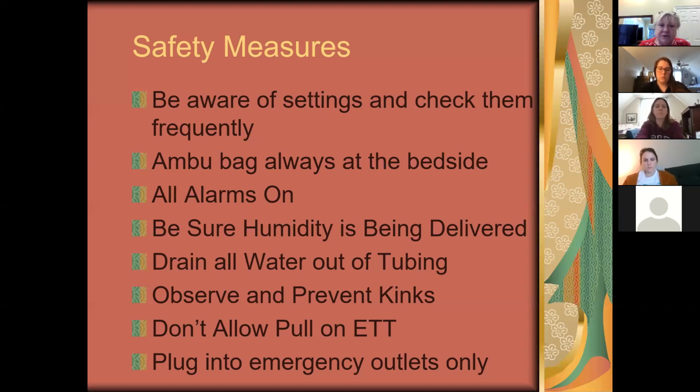If your patient is unstable because they're alarming, then take them off and bag them until respiratory gets there. If they keep alarming but it doesn't seem like there's anything wrong, their PO2s are good, their SaO2s are good, everything seems to be fine, then leave them on there. But if it's a high pressure alarm, then go over and suction them. If it's low pressure, find out why. Are they really being ventilated, or is there something wrong with the machine? But if you have any question, take them off and bag them until respiratory can get there.